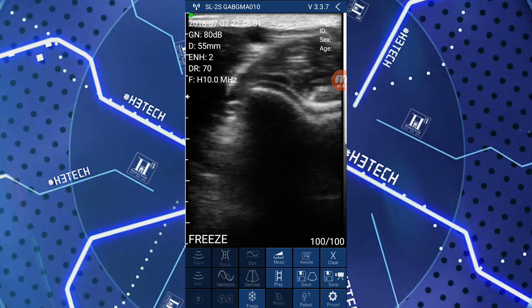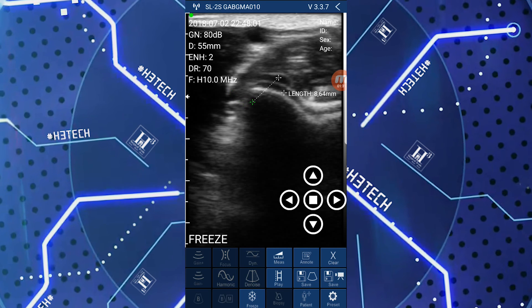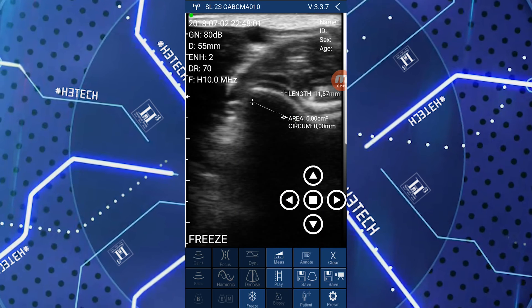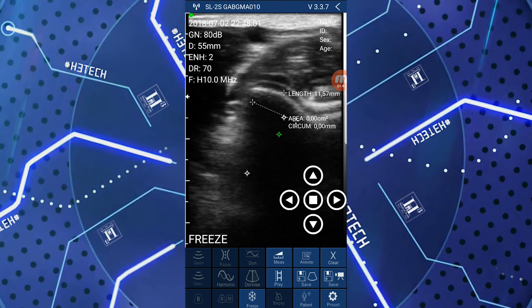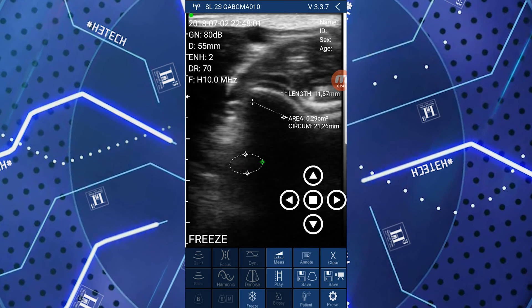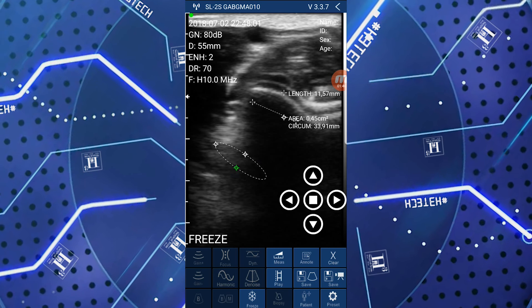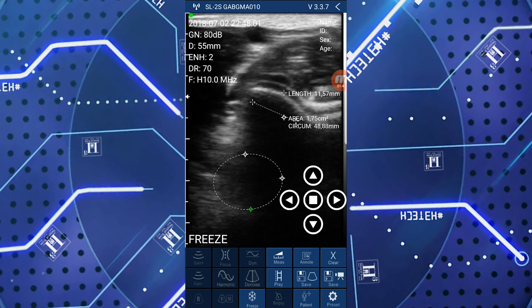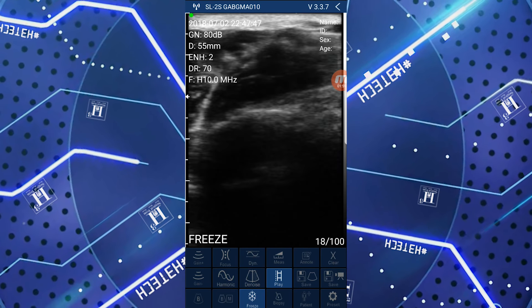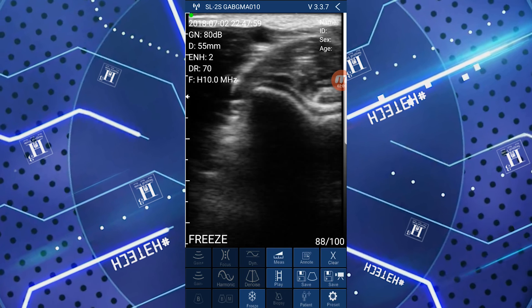Now let's see an example with the freeze function. What happens is that the image freezes, and from this point we can use the measurement function to measure, for example, a nodule or the caliber of a vessel. We can also measure an area by tracing a circle of various sizes and the ecograph will calculate the area of the portion we are studying. We can press play and it will automatically show the last hundred recorded frames. We can save the image or save the video.